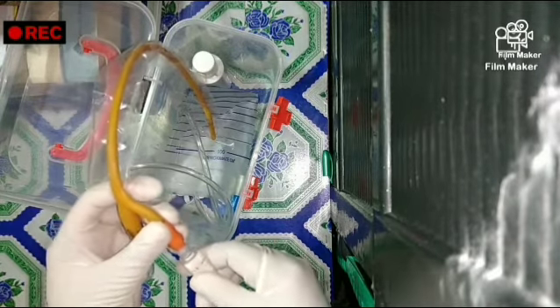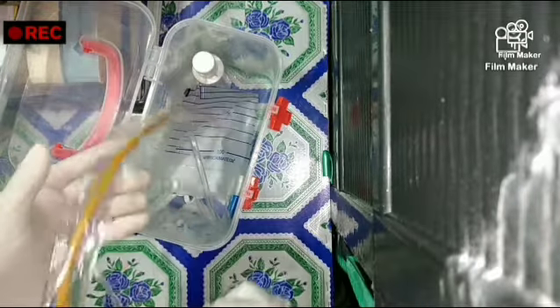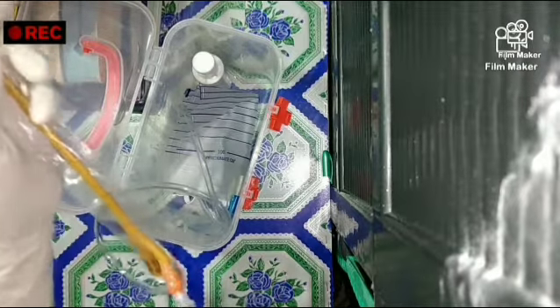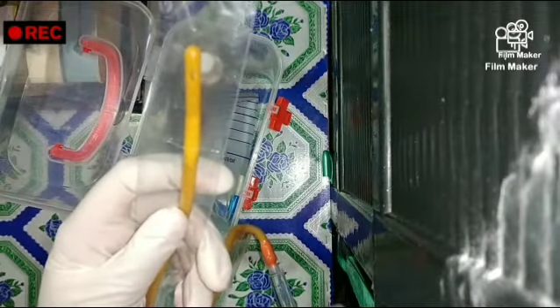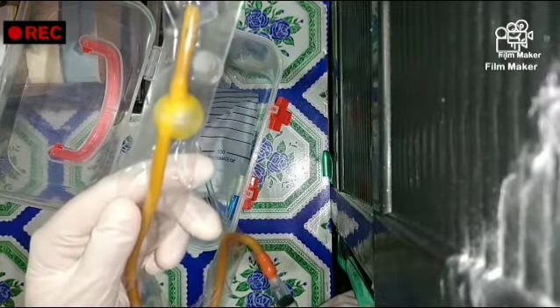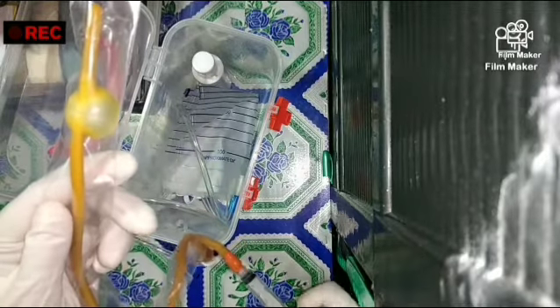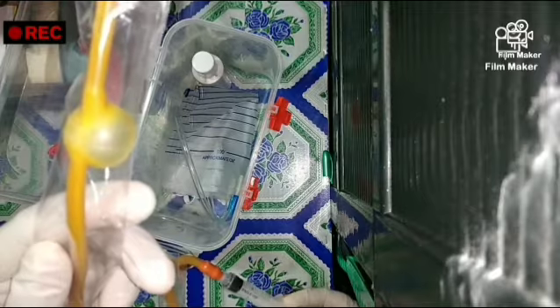But first I will check if it will inflate the balloon. So yes, it is good. It will deflate.